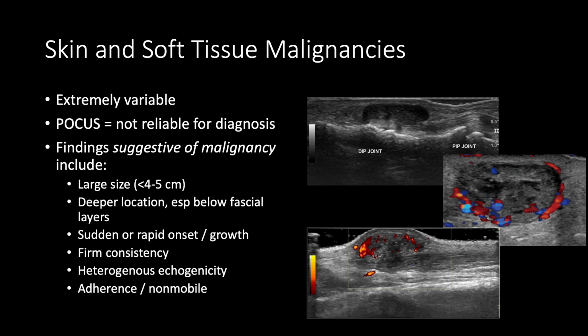And here I've just chosen a couple of different things, some of which are easy to pick out. Like you might say, hey, this middle one here has some abnormal flow to it. It's got some echogenic components. It's got some hypoechoic or anechoic components. It's a solid structure. It's firm to the touch and palpation, non-compressible. And so those things would likely raise your suspicions.